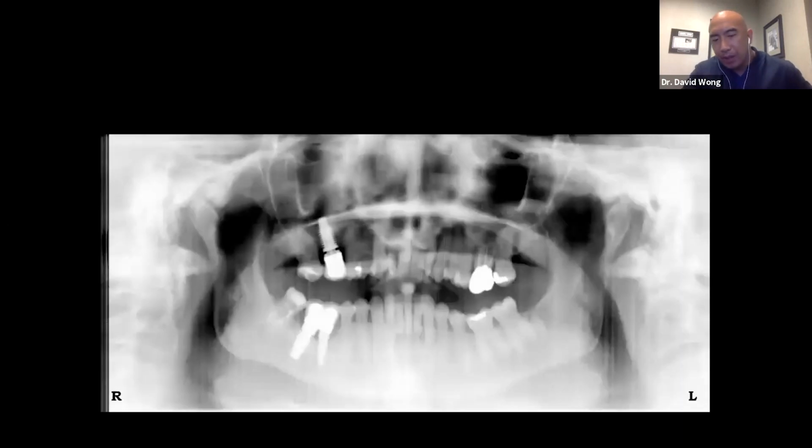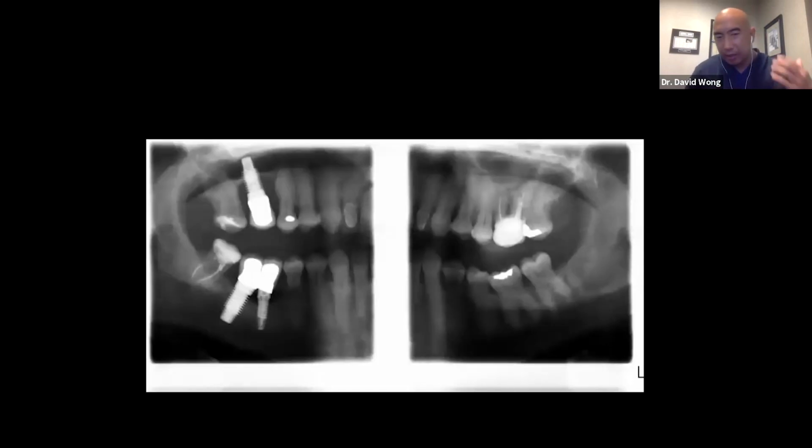What happens is if a patient isn't aware of it, doesn't tell you about it, or we glance over it and don't realize it, the bone at first will be unaffected, but just like an open margin on a restoration, it becomes a plaque trap and you have a bacterial pump. So the next radiograph, you're going to see 50% bone loss or more around the implant. Now, of course, we tighten it down, but it's too late. The bone is gone from the implant. So be sure that we check those implants at the maintenance visits.